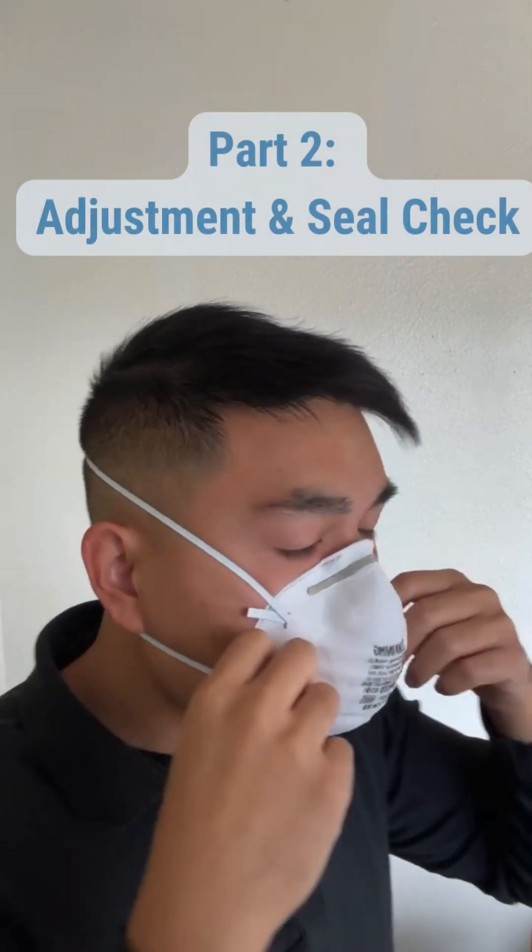Part 2: Adjustment and Seal Check. Adjust your N95 respirator to fit snugly around your face by pinching the nosepiece to get a good tight seal.